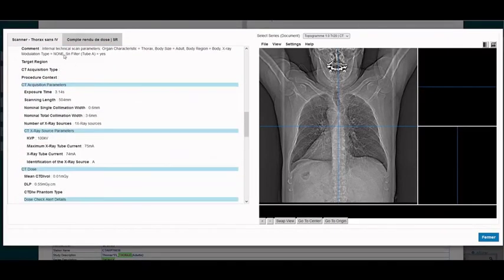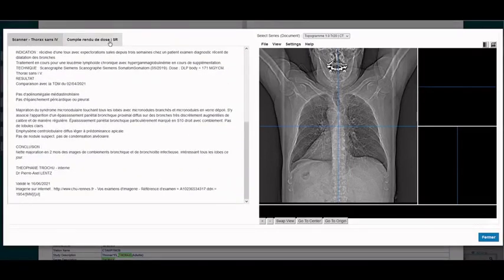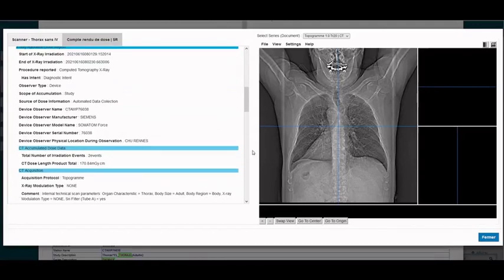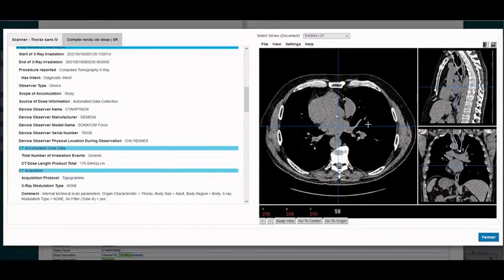On the left we have another imaging report. And obviously I can see the CT scan we saw earlier in this global view. So again, it loads from the PACS. And we can see all acquisitions and reports from the same imaging exam, the same DICOM study.